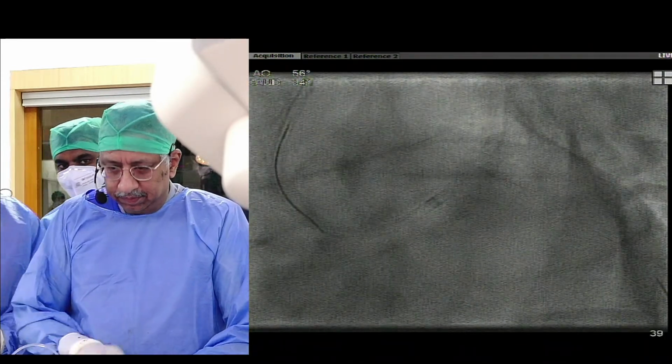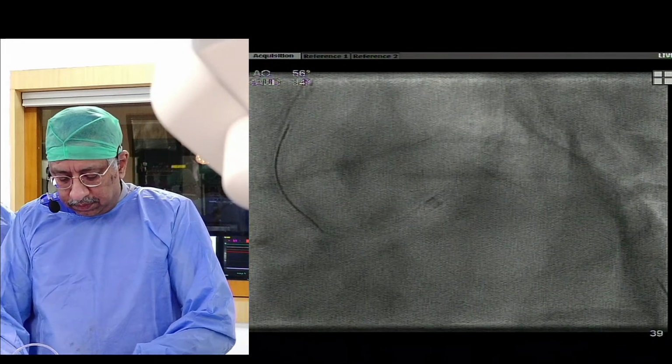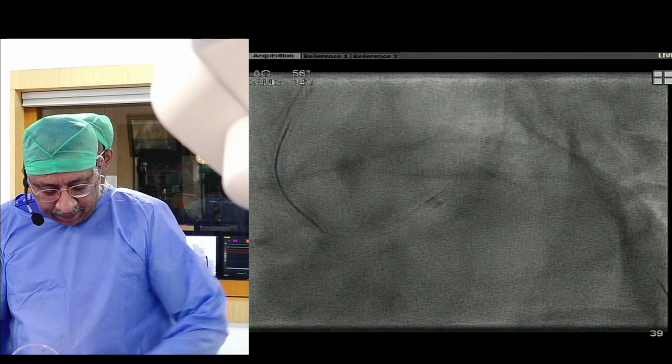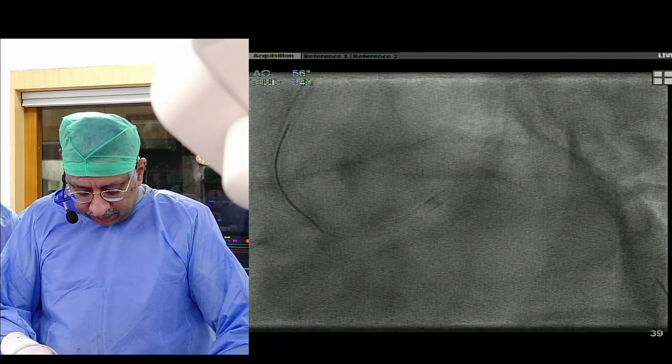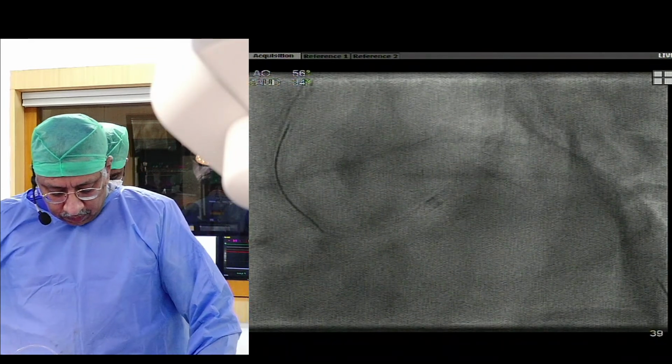Thanks, Sid, for this opportunity. Can you hear me, please, and see my slides? I'm just going to show you a couple of cases. Can you give me another wire? A calcified nodule, which I ended up stenting. I'll show you some very interesting cases where we deferred stent implantation.